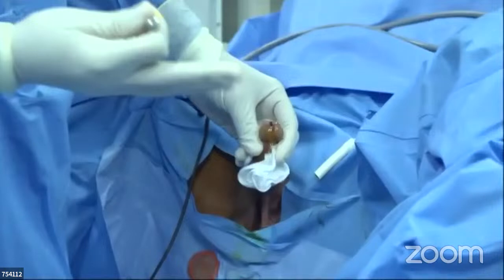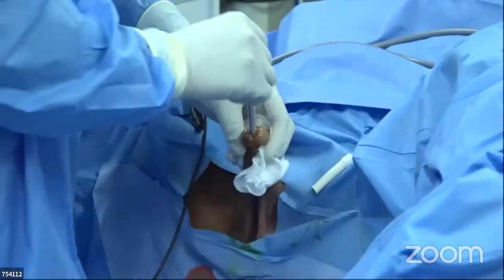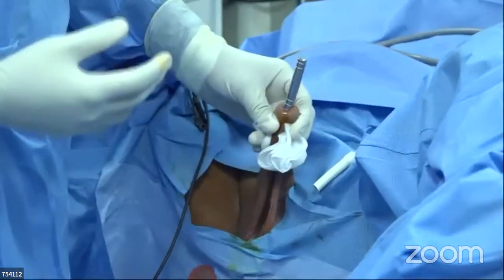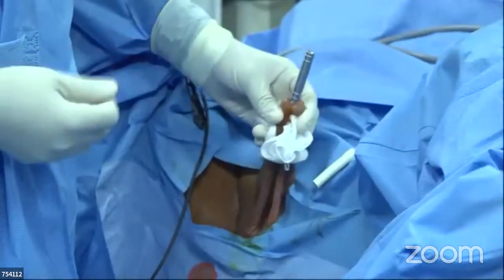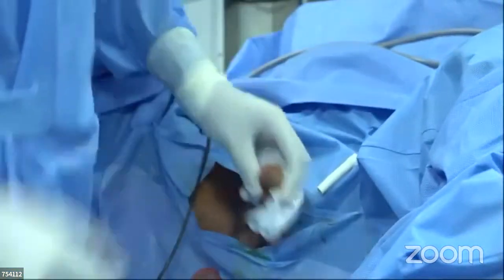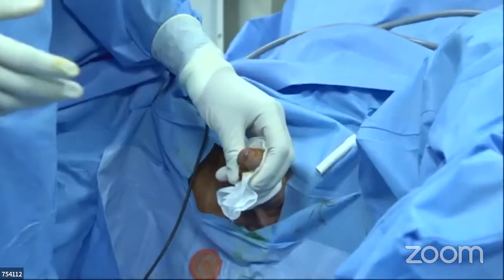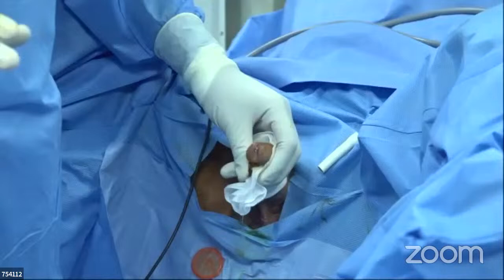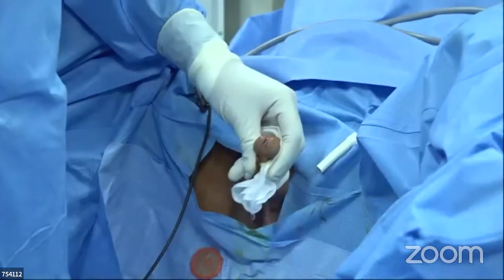In fact, we have shifted to a mini endoscope, etc., wherein we are using a 22 sheath for continuous flow. Probably they are ideal for the future, because at the end of this experience, we started realizing that it is the instrumentation, and the size of the instrumentation does have a role in the incidence of stricture in the postoperative period. I can't say I have scientific evidence for that, but we do believe it.